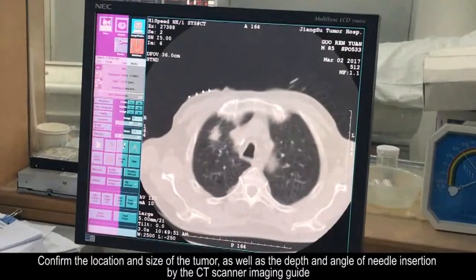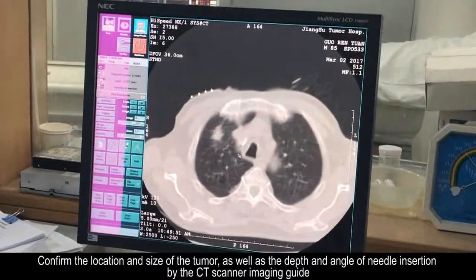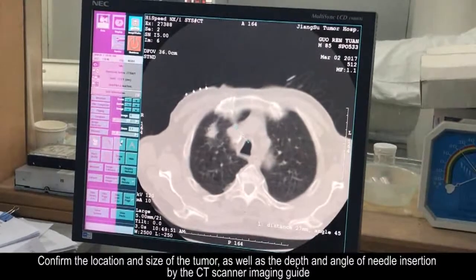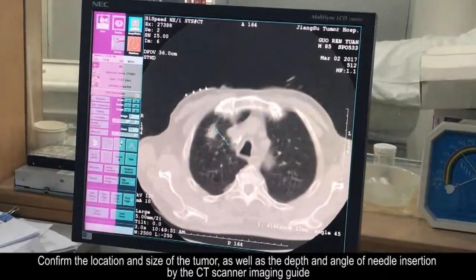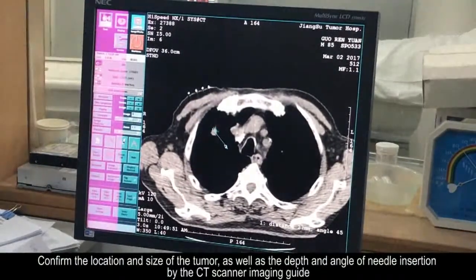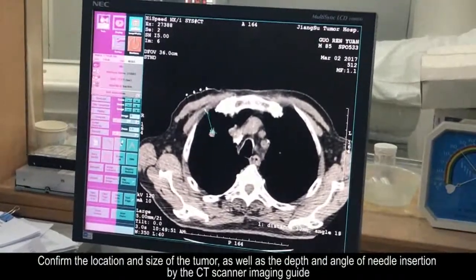Confirm the location and size of the tumor, as well as the depth and angle of needle insertion, using the CT scanner imaging guide.